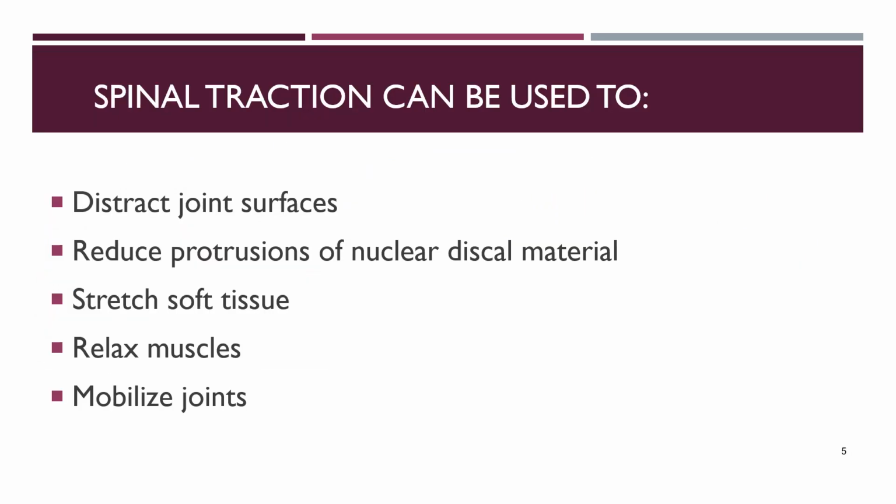So let's just talk about some of the reasons that you could use mechanical traction. Let's look at these bullet points here. We can use mechanical traction to distract the joint surfaces, and we'll talk about reasons why you'd want to do that here in just a little bit.